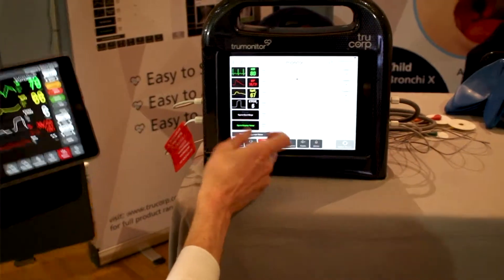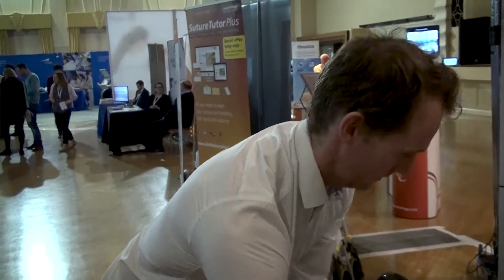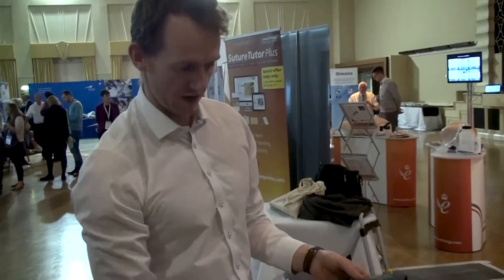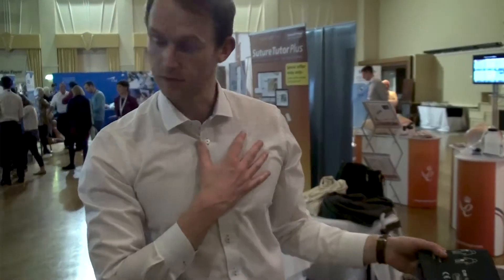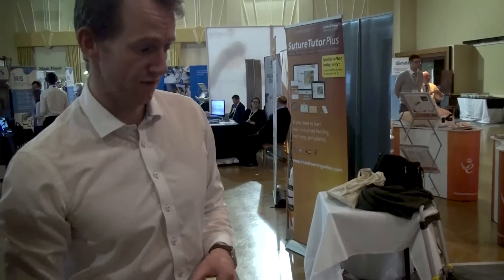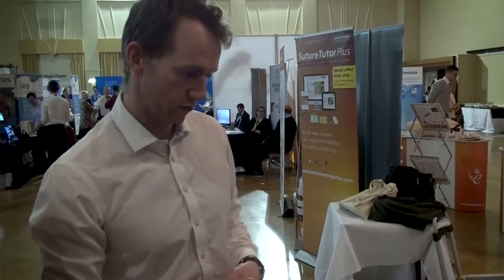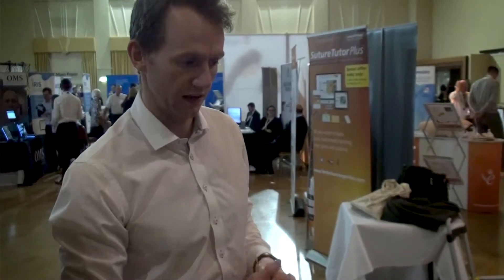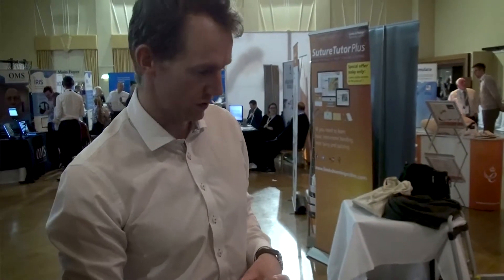They've also got the added advantage of a more immersive simulation setup with the AED pad — you can see all the pad placements as well. This is True Monitor, a very good new product made by Truecorp. It's a brand new innovation and we've had a lot of clinical input into this product. We're really happy with it and think it's going to do very well in the UK and the rest of the world.